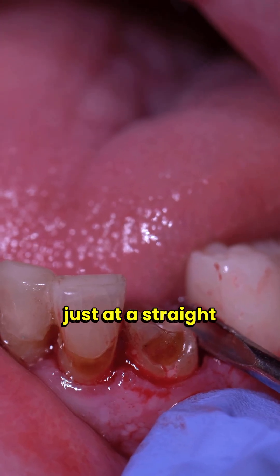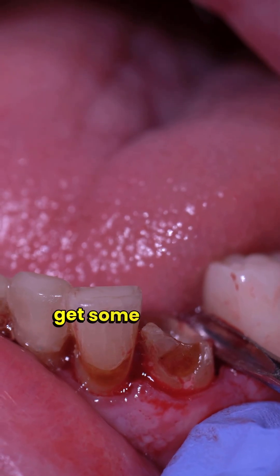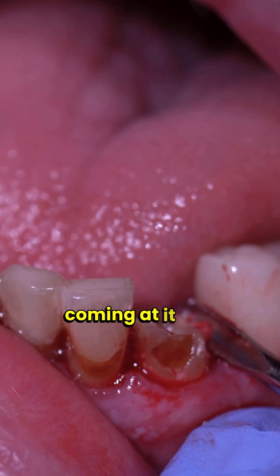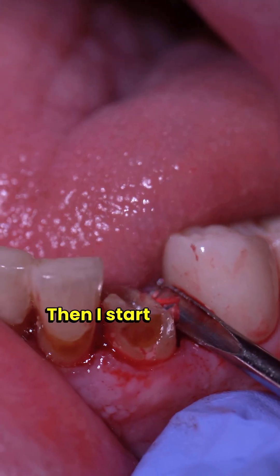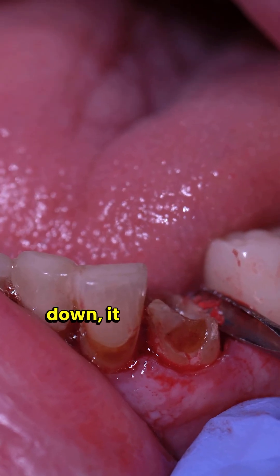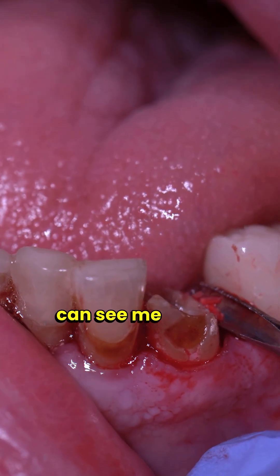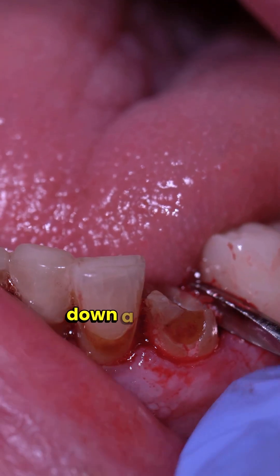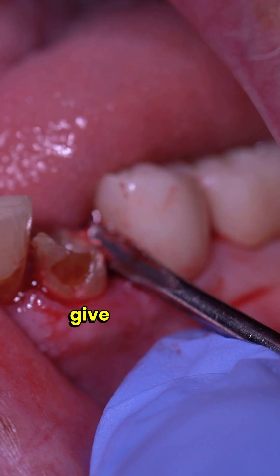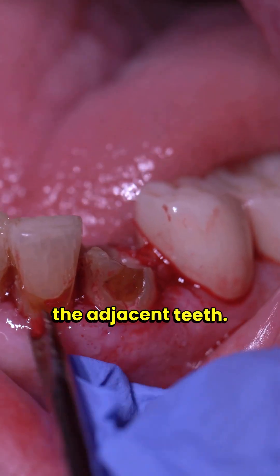Coming at a straight 90-degree angle perpendicular to the tooth, once it gets some mobility I start to change the angle so I'm not coming at a straight 90 degrees — I start bringing that down a bit, and as I bring it down it pushes that tooth upwards. I give it a little bit of time, and you do want to make sure to be careful of the adjacent teeth.